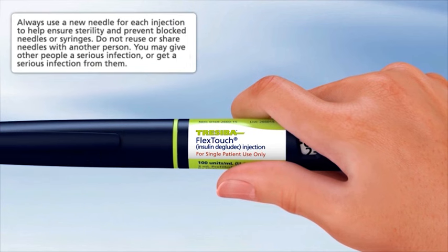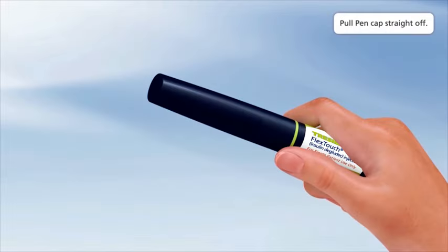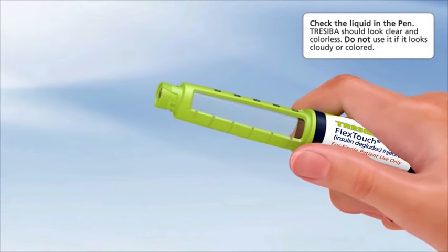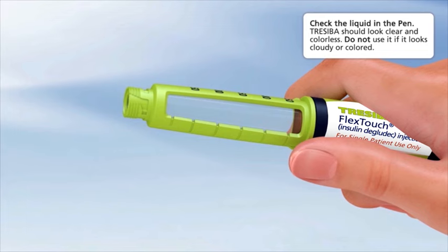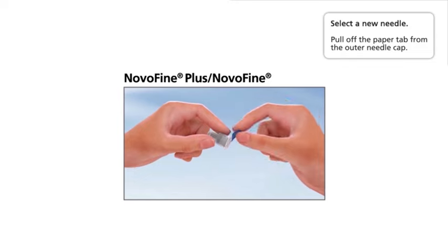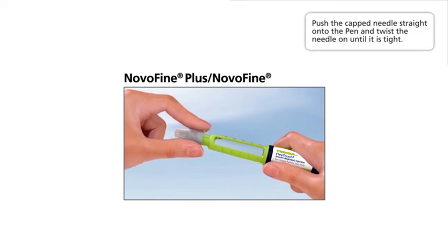Always use a new needle for each injection to help ensure sterility and prevent blocked needles. Do not reuse or share needles with another person — you may give other people a serious infection or get a serious infection from them. Pull the pen cap straight off and check the liquid in the pen; Traceeba should look clear and colorless. Select a new needle, pull off the paper tab from the outer needle cap, push the capped needle straight onto the pen, and twist the needle on until it is tight.